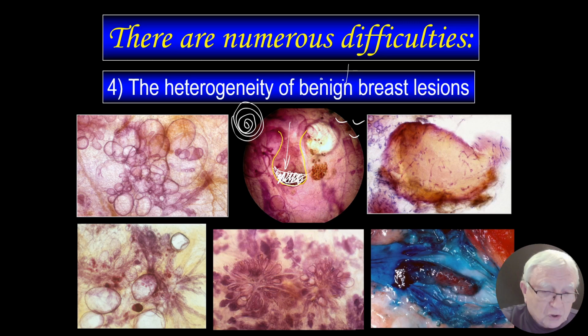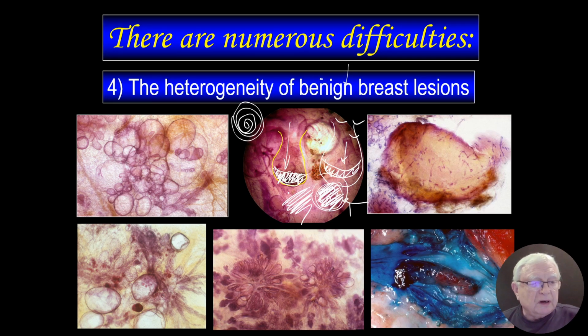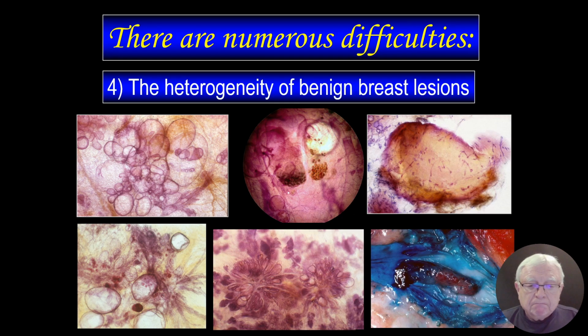We take a picture from above, and we are going to see a breakfast plate seen from above, without the details. So you see, when we have this picture and this picture at 90 degrees, then we say, sure, dense breast, which means fibrosis, and this must be in the bottom of a lake we call a cyst, fibrocystic change.